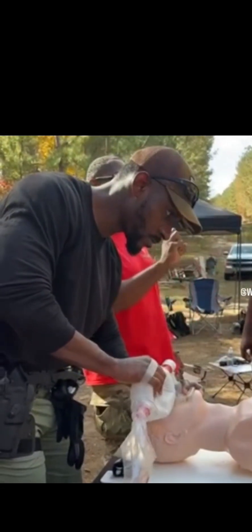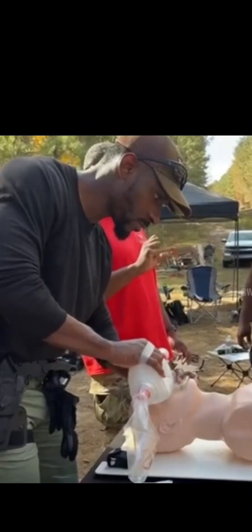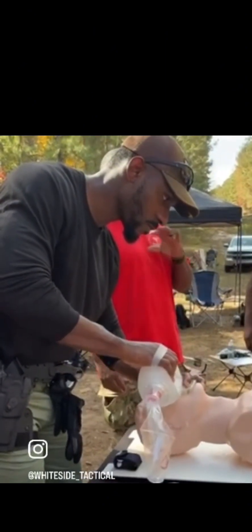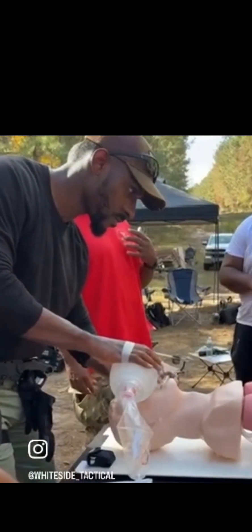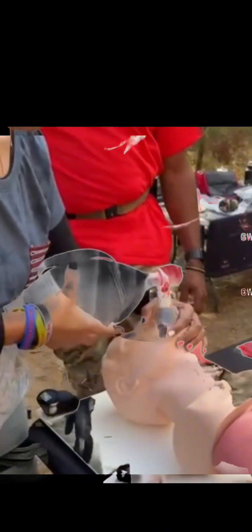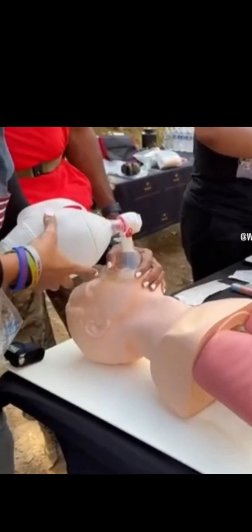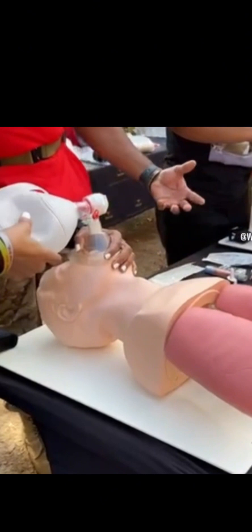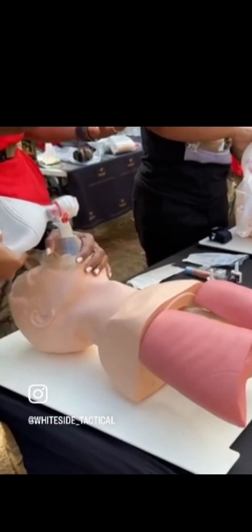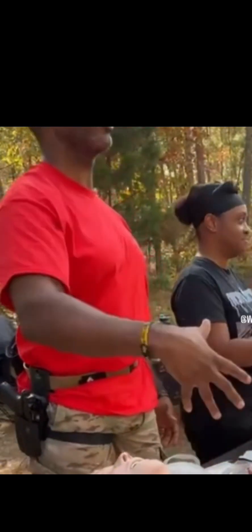You don't even have to squeeze the bag all the way — just a nice little squeeze and you're getting oxygen into the lungs. When you squeeze, you'll see my chest rise and fall. We like these because when you're doing CPR they say breathe — but with the bag valve mask, now you can actually see what's going on and how the lungs inflate. It's a better representation of what's actually happening.